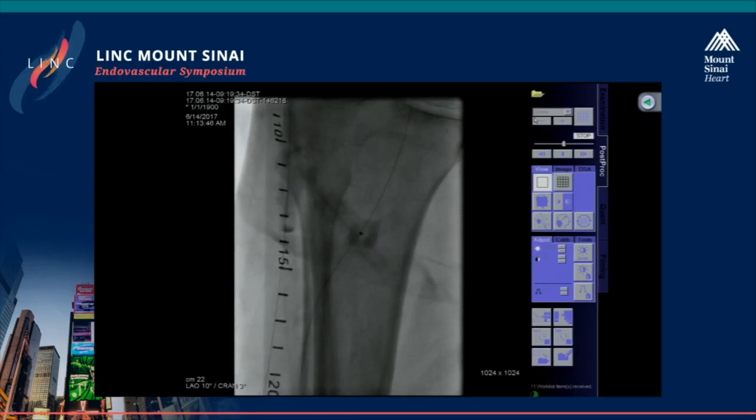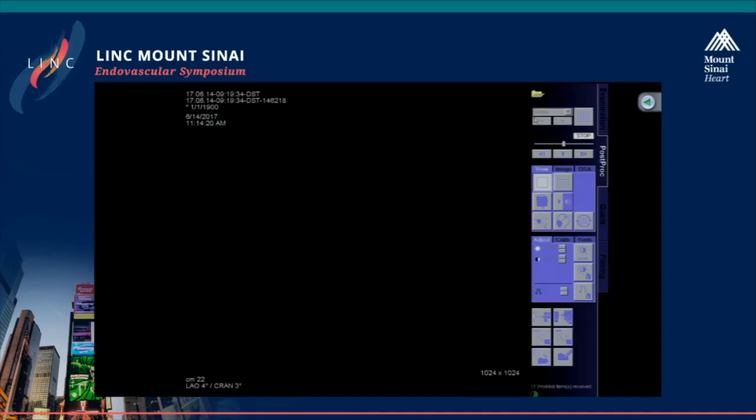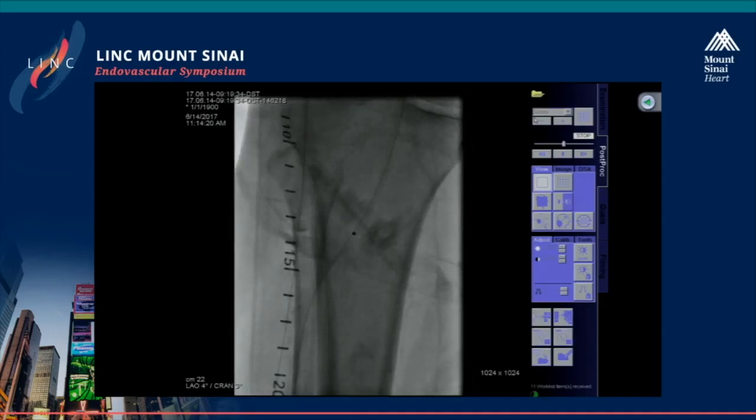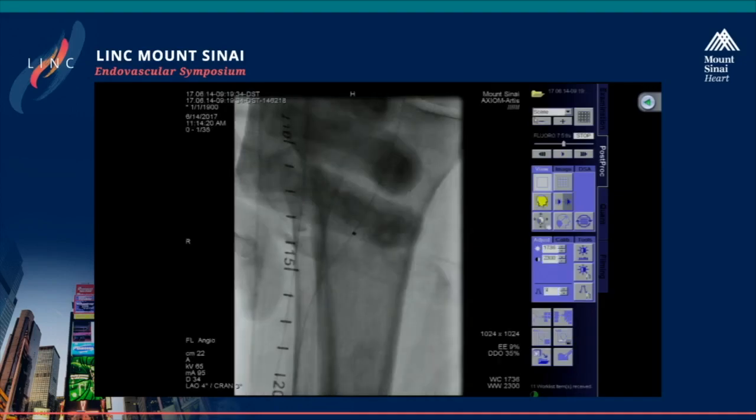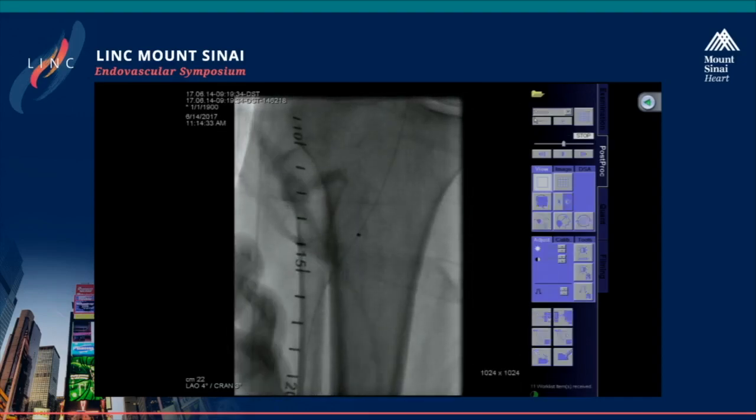Yep. While you're positioning that, PK, in answer to your question, I think you've already got a chocolate balloon out. I think atherotomy and DCB of the distal SFA, and if you get a good result, you're done. Yep, that's what I would say. And then you can always stent with a Supera if you need to. All right, so we're just going to go ahead now and put up this DCB. Go forward a little bit. You want to go a little bit more?